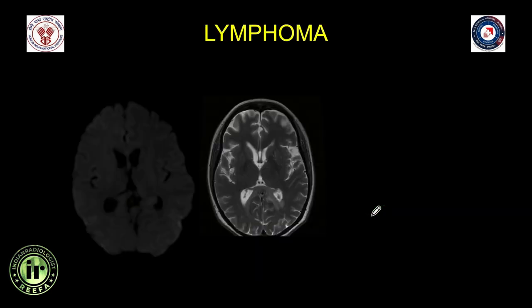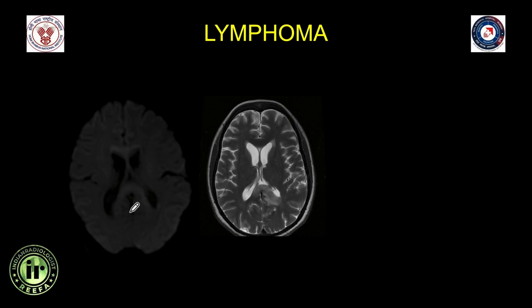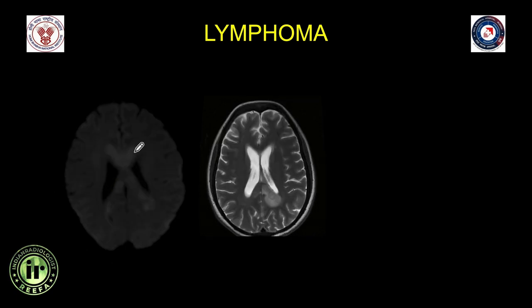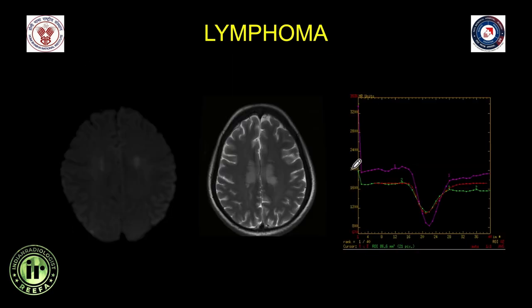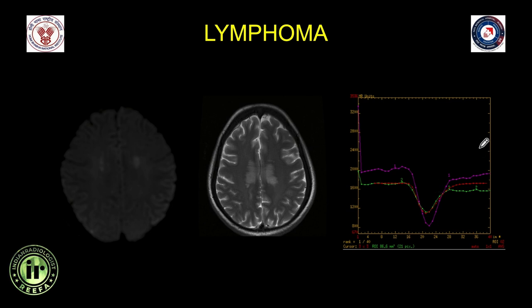Another lymphoma example shows a periventricular lesion with restricted diffusion, intermediate to hyperintense T2 signal, and hyperperfusion — confirmed as lymphoma. However, baseline overshoot is not seen here because leakage correction algorithms were applied. Remember: absence of baseline overshoot does not rule out lymphoma.